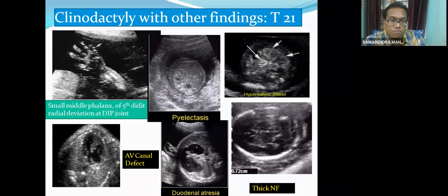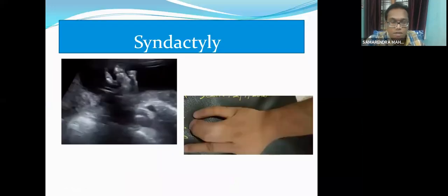So this is to depict that whenever we get a single piece of information regarding any abnormality or anomaly, we have to go further and look for other abnormalities in and around, because skeletal abnormality most of the time may be associated with other abnormalities. It may be isolated also. It may be unilateral or bilateral. It may be syndromic, or another deformity sequence might be there.